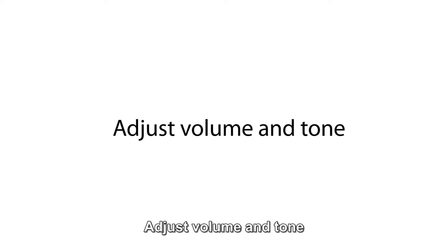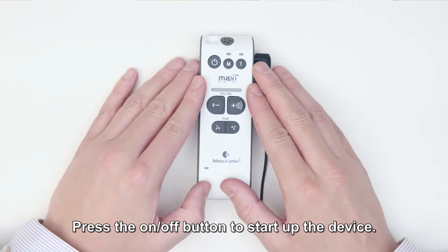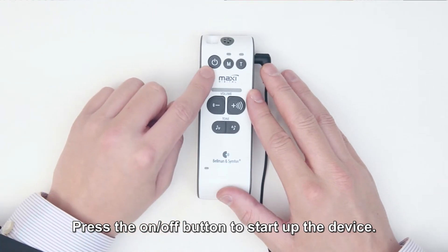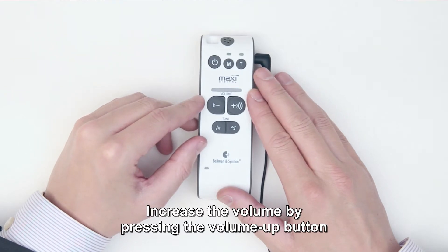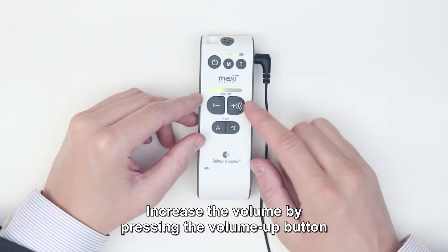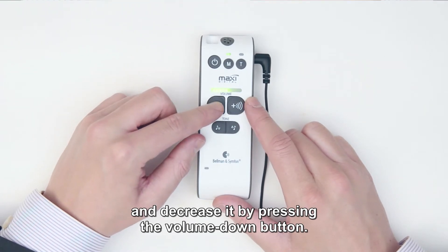Adjust volume and tone. Press the on-off button to start up the device. Increase the volume by pressing the volume up button and decrease it by pressing the volume down button.